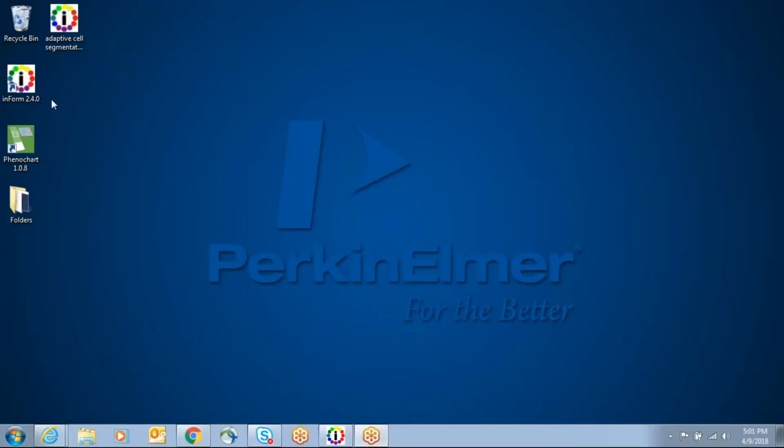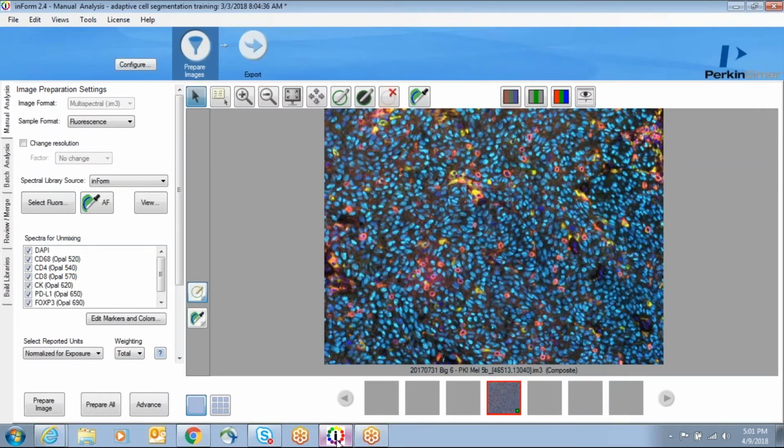Hello everyone, and welcome to inForm 2.4, PerkinElmer's brand new adaptive cell segmentation algorithm. What we have for you today in this video is an inForm project that we've already started.